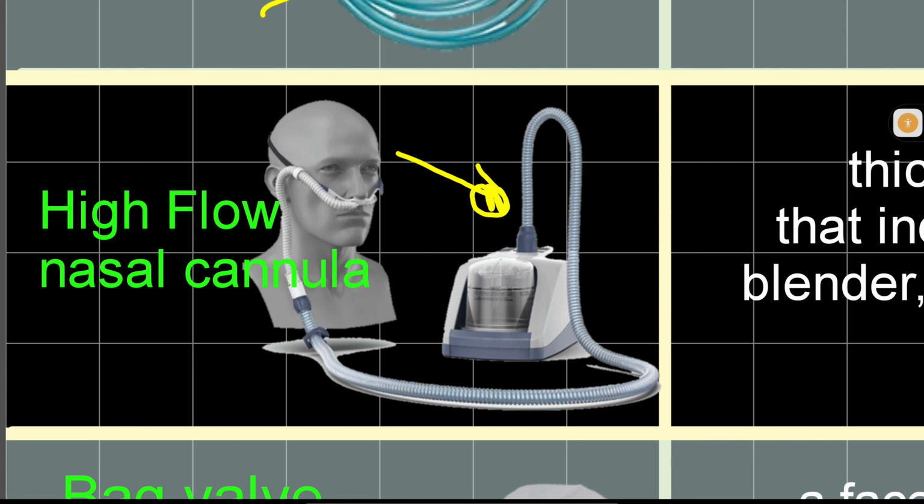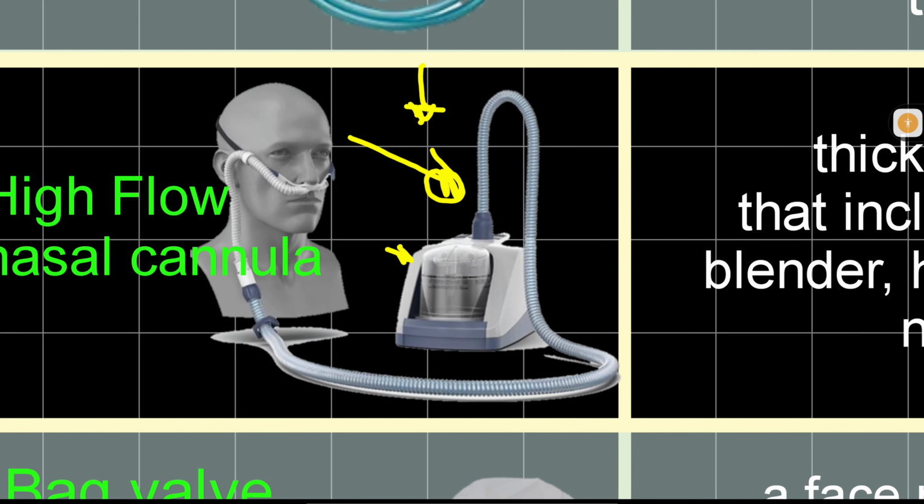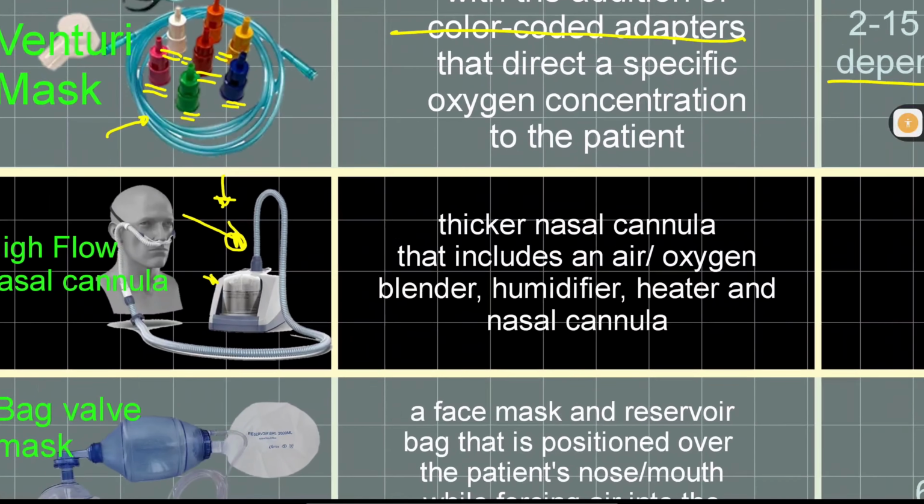Normally, ang high-flow nasal cannula natin, binibigay natin to kapag sa pasyente, last resort niya to bago siya i-intubate. Meaning, kapag hindi pa talaga effective ang saturation, nagdidisat pa rin, high-flow nasal cannula. Ito po itsura niya. Nakakonekta siya sa machine, tapos meron tayong normal saline dyan para ma-make sure natin na we're also giving humidification to the patient. Normally ginagamit din siya post-extubation para hindi naman mabigla yung katawan ng pasyente sa pag-wean off mo sa kanya sa mechanical ventilator. Okay? Don't worry, I'm gonna discuss that to you.